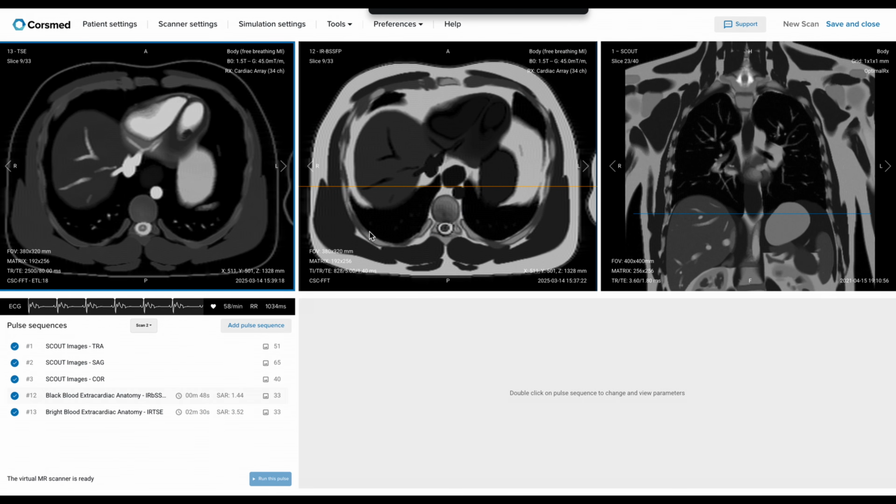So let's now go ahead and start the function assessment. In cardiac MRI, we usually study the function of the heart, mainly the left ventricle, unless the clinician tells us otherwise. If we notice anything unusual in the right ventricle, then we run a separate dedicated scan for that area. For this first video, we'll focus on the global function of the left ventricle.